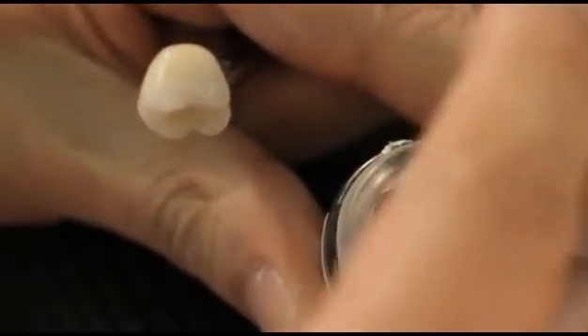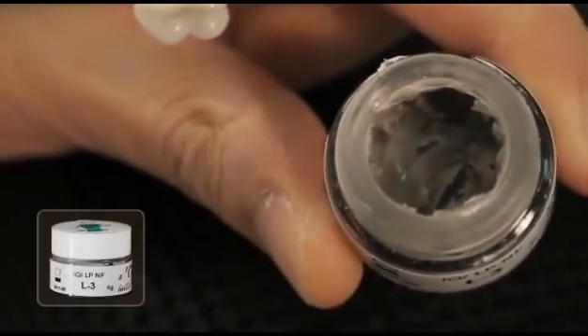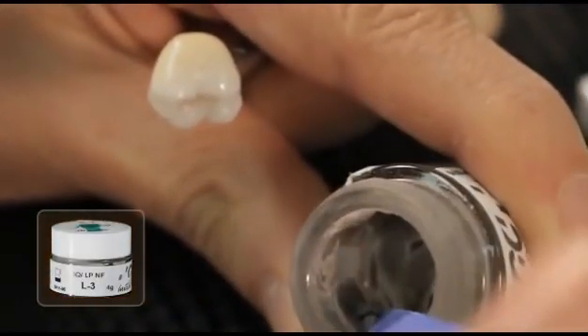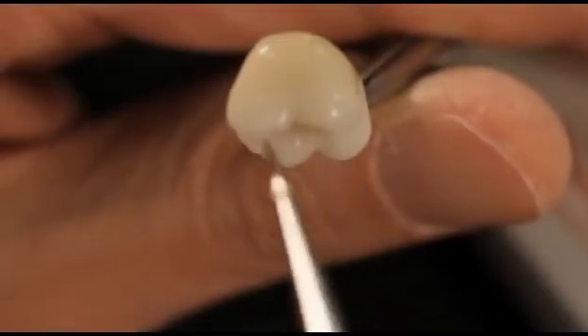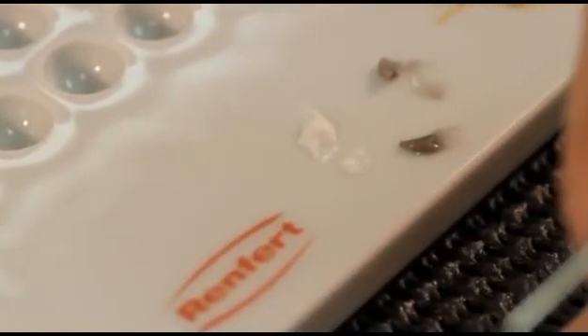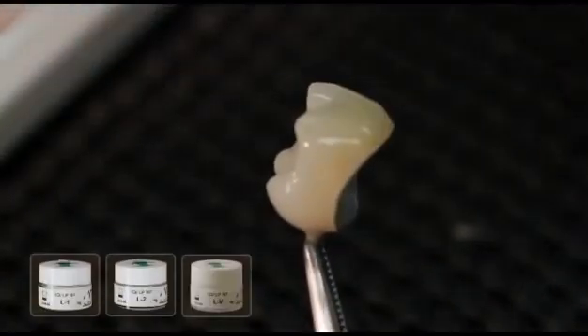In order to achieve the higher gray value of the incisal area with darker teeth, two gray effect shades can be used: L3 light gray and L4 dark gray. For further individualization, you can use the whitish Lustre Paste NF — L1 vanilla and L2 white — and an LV value for brightening the restorations.